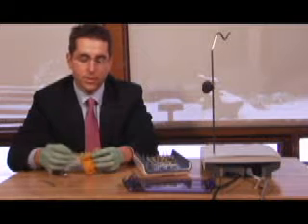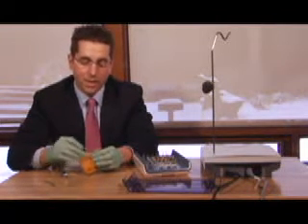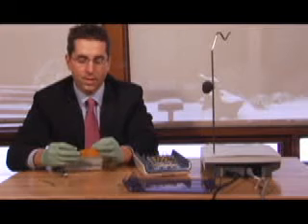You don't want the implant too far to the distal. You create a mesial cantilever and too large of a crown. And you also don't want the implant too close to the other tooth, because when you infringe on that tooth, you could cause an endodontic problem or a problem with the root of that tooth.